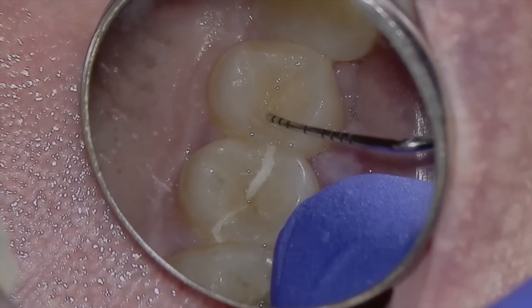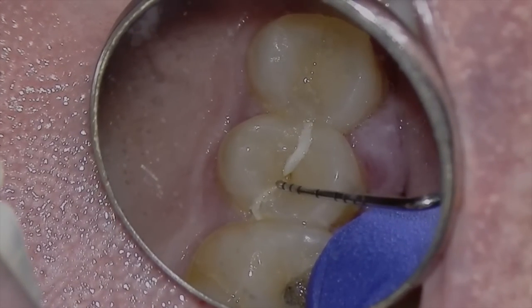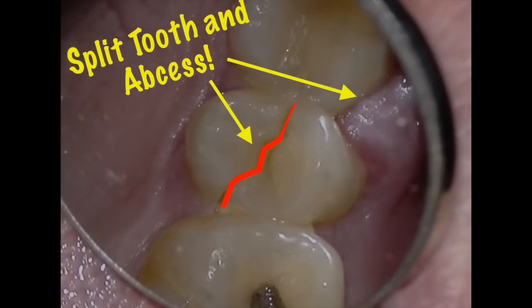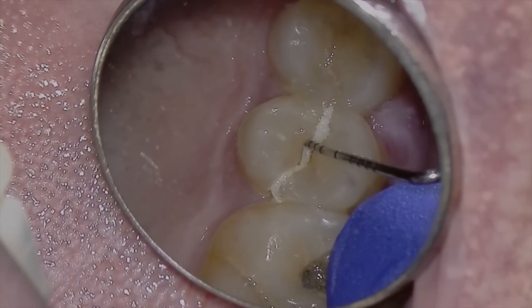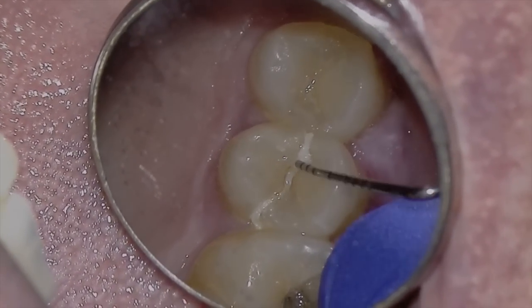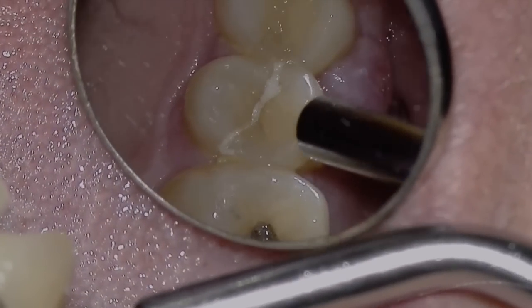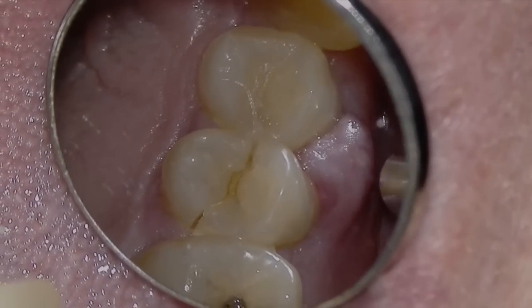Here is the split tooth — second upper right premolar, tooth number 1-5. You can see the patient's filled with food debris. When I first saw that, I'm like, well, here we go. As the thumbnail has it, we have a split tooth and a gingival abscess to go along with it. What we're going to do here is flex it to make sure it is a split tooth, and we're going to apply air and blow some of that debris to see how deep the fracture is.